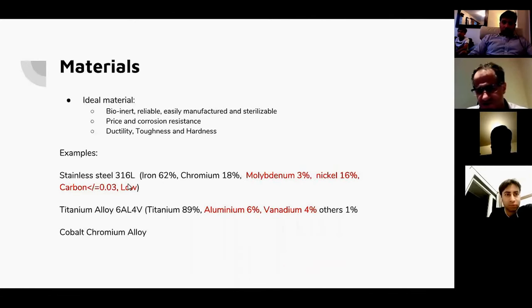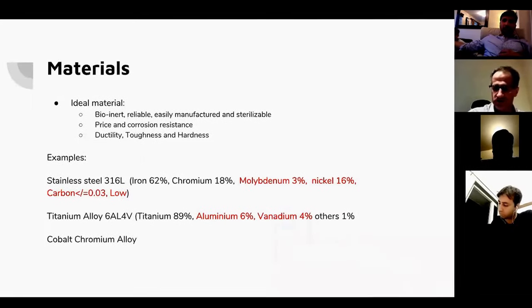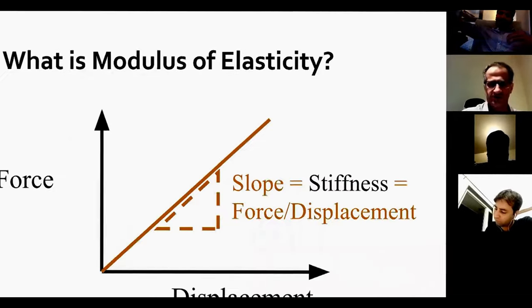Why do we use the 316 series? Why do we use the 300 series, but specifically the L series? The reason why is the low carbon is more resistant to corrosion in the human body because of sodium chloride in the body. So this is a plate or metal that is used in the oceans and seas by engineers there, and it has the same resistant properties as it would have in the ocean because our bodies are essentially salt. So that's quite a trick to that question, but once you get that one out, you're saving yourself trouble.